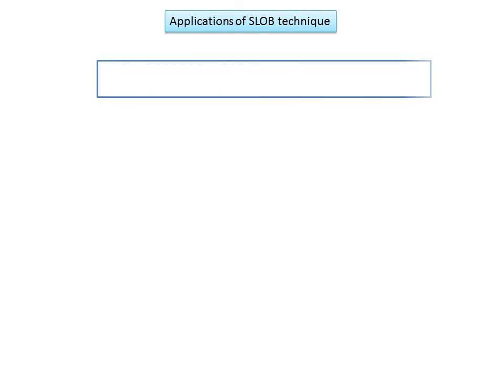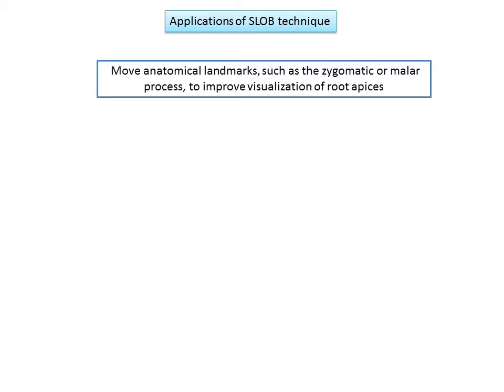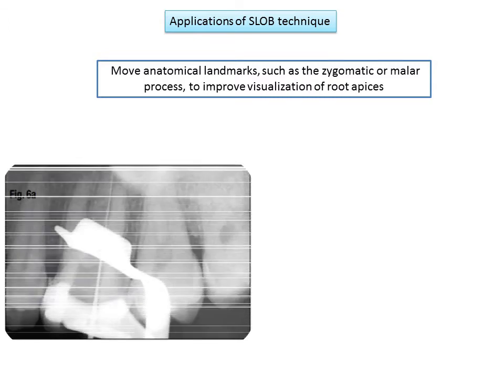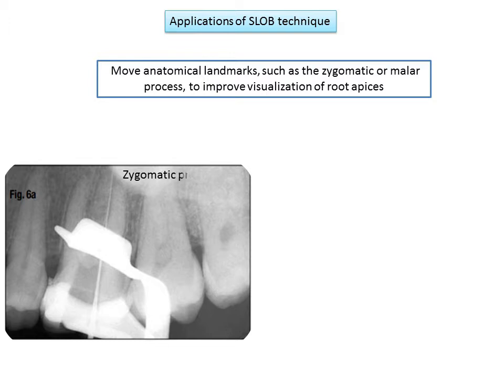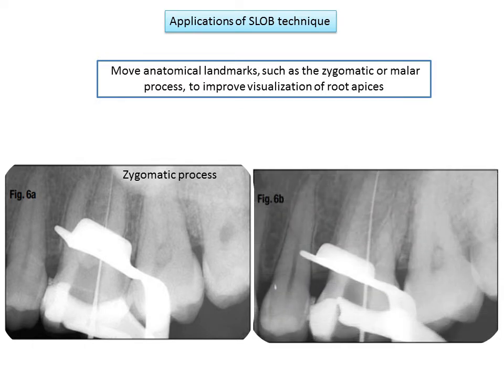Another application is moving anatomical landmarks such as the zygomatic or malar process to improve visualization of root apices. In the first image, the shadow of the zygomatic process completely obscures the apex of the palatal root of the upper first molar. In the second image, after angling the x-ray machine mesiodistally and slightly coronoapically, the shadow is removed and the root canal is easily visualized.